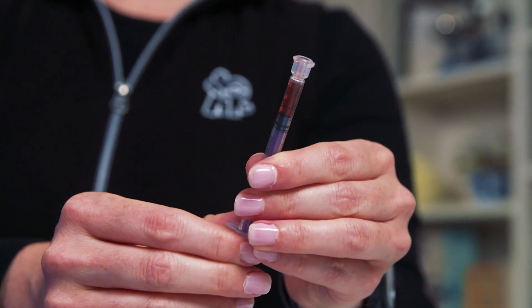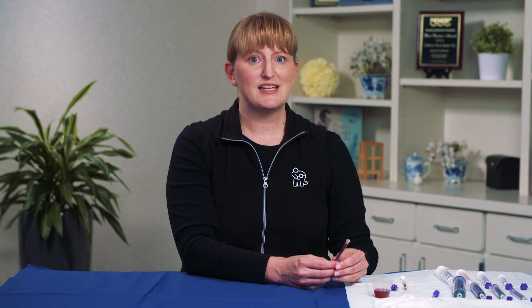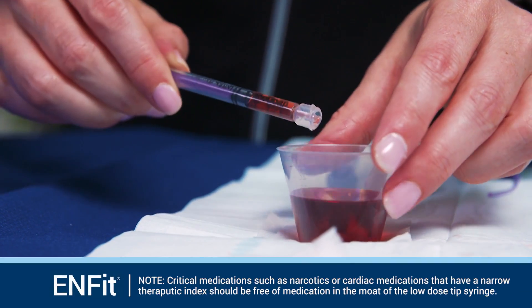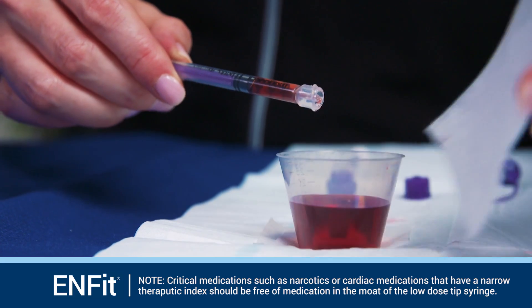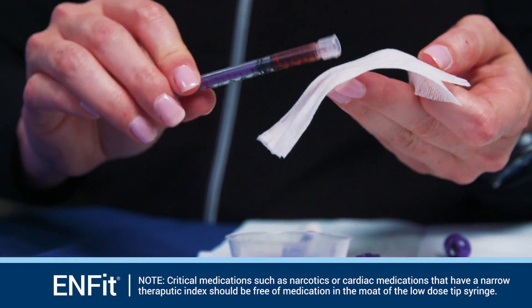When filling the NFIT low dose tip syringe, be aware that the moat at the tip of the syringe may fill with additional medication. Tap the end of the syringe on a clean cloth or the edge of the cup to dispel the extra fluid. For thicker fluids, use a clean cloth to gently wipe the outside and around the tip of the syringe to remove extra fluid.